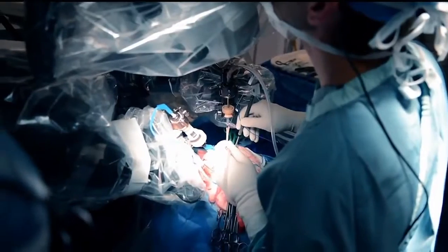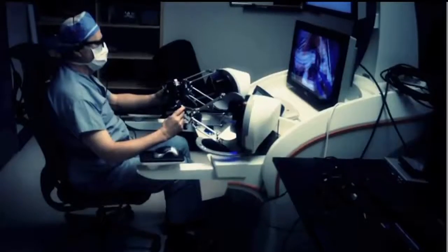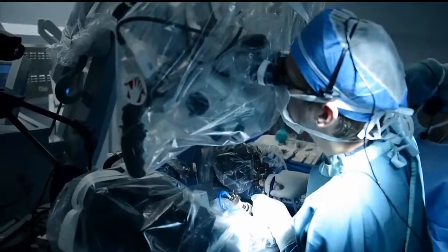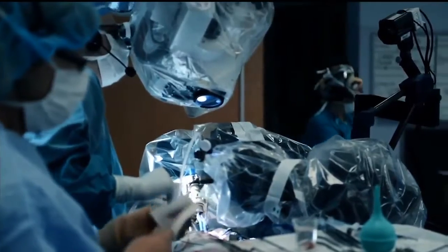The robot has two arms connected to a base. The robot's arms are much like a human's arms, and they have joints, much like a human's hands have joints. The surgeon controls that larger robot using hand controllers, which are really miniature robots. So however the surgeon moves their hand, the robot moves. The robot is slave to the motions of a human surgeon.